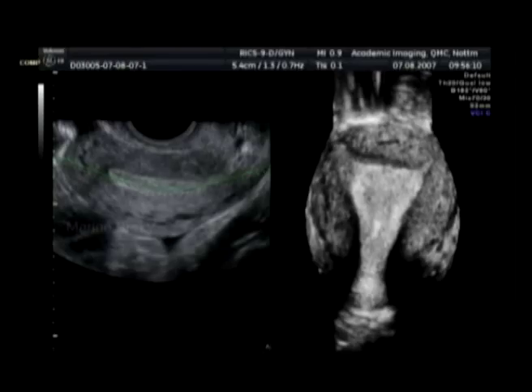And you were saying about the uterus abnormalities on 4D scan. So apart from pregnancy, where 4D ultrasound can be of major use is in the evaluation of the uterus, especially in cases of infertility. There can be certain congenital anomalies in the uterus where the uterine cavity can be split by a septum, or there can be two different cavities. All these things can be very clearly shown on 4D scan because we can see the structure in different planes, especially the coronal plane which I mentioned earlier, which is not possible to see with two-dimensional ultrasound.